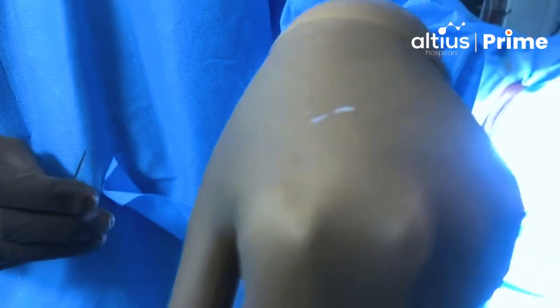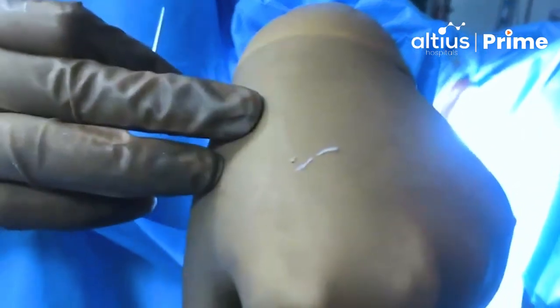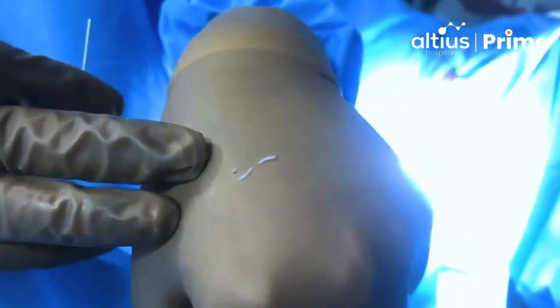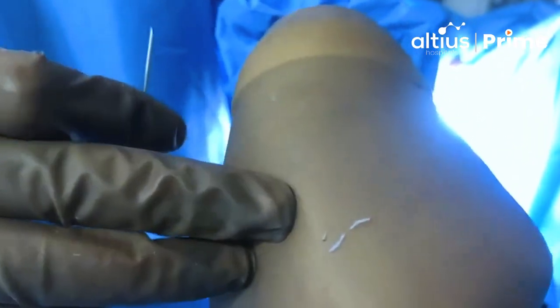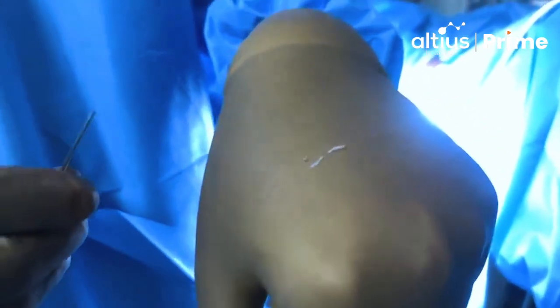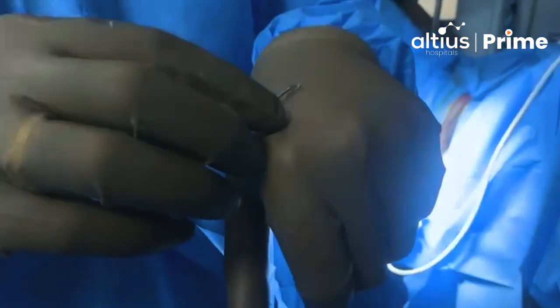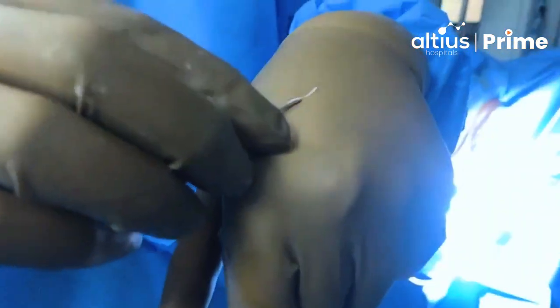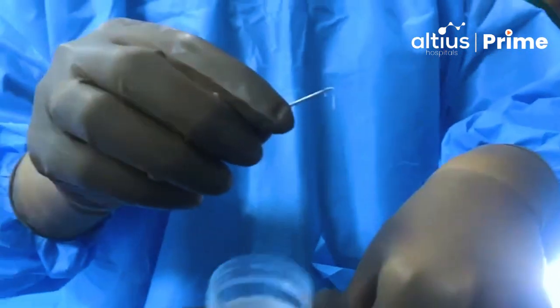It is a myth that via transvaginal or transrectal route insufficient material is obtained. On the contrary, the quality of tissue we got here is comparable to any other percutaneous methods of sampling. This is also an easy method — I spent only roughly one to two minutes obtaining this sample.